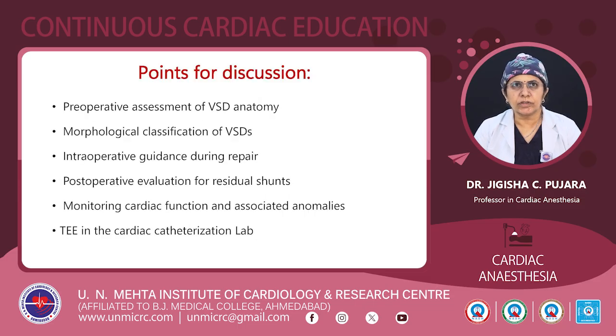Here the points of discussion will be preoperative assessment of VSD anatomy, morphological classification of the VSD, intraoperative guidance during the repair, post-operative evaluation for residual shunt, monitoring cardiac function and associated anomalies, and TEE in the cardiac catheterization laboratory.